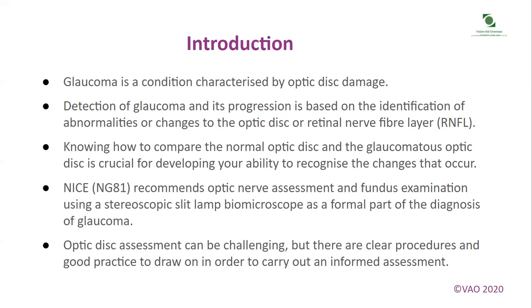NICE NG81 recommends optic nerve assessment and fundus examination using a stereoscopic slit lamp biomicroscope as a formal part of the diagnosis of glaucoma. Optic disc assessment can be challenging, but there are clear procedures and good practice to draw on in order to carry out an informed assessment.